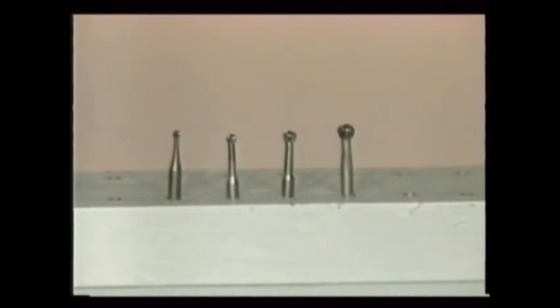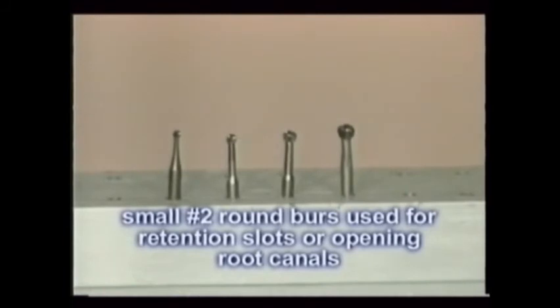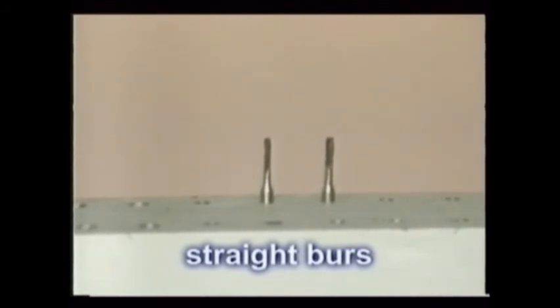In general, large shanked number 4, 6, or 8 round burrs are used to excavate decay. The number 2 round burrs are used to create retention slots for fillings and are sometimes used to open pulp chambers during root canal therapies. Straight burrs, like the number 57 shown on the left here, create parallel walls and rapidly remove dental structures. Number 557 burrs are similar, but have slightly larger and more cutting edges.